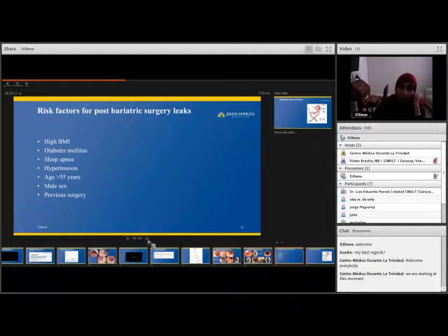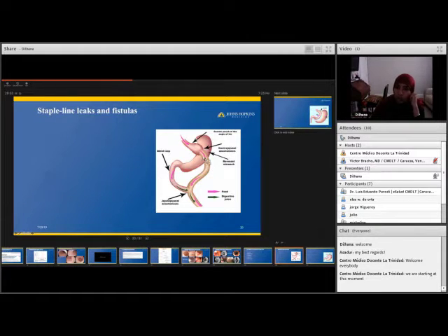And now the stent is being secured with a couple of sutures, and this is the gastrogram with the stent present, and you can see that that stricture has now opened up significantly.